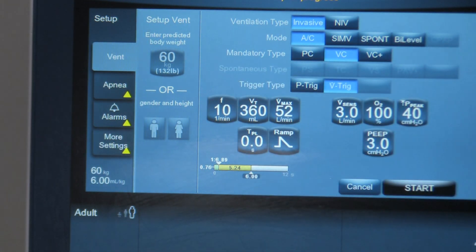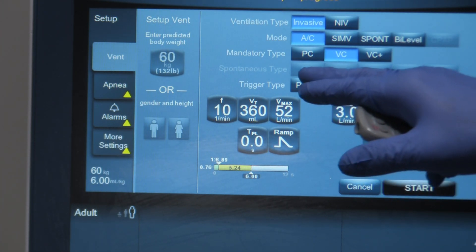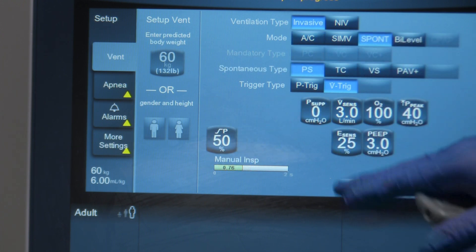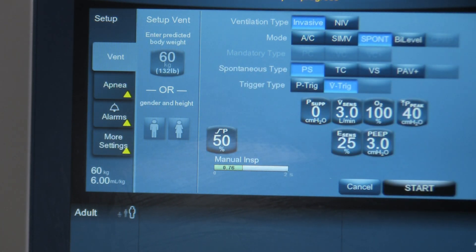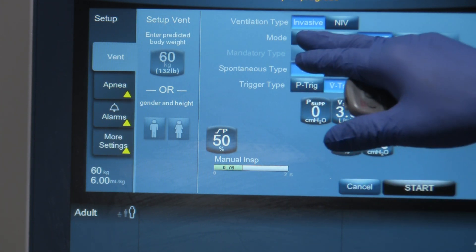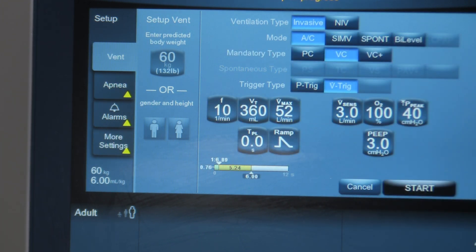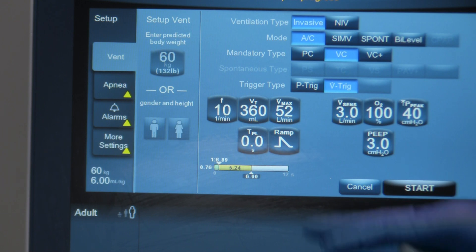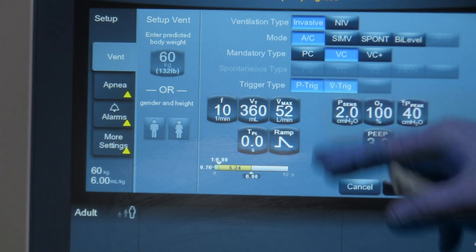The next item is the spontaneous type, which is a bit subdued in its writing. Spontaneous type means what type of breath or mode you want the patient to get if they're in spontaneous mode of ventilation. Because we're not in spontaneous ventilation right now it doesn't allow us to choose — it would light up if we chose a spontaneous-style mode. The next choice is the trigger: flow trigger or pressure trigger. We'll leave it with flow triggering.